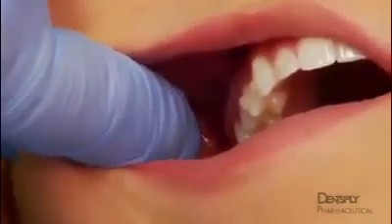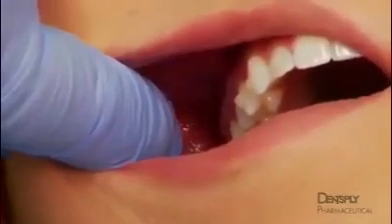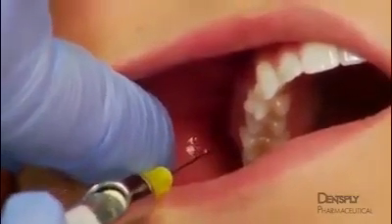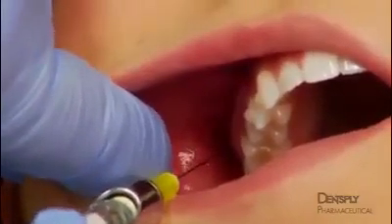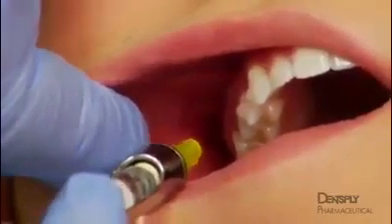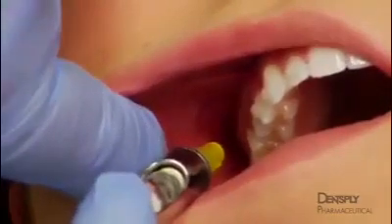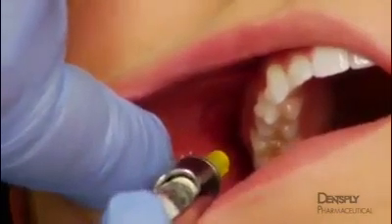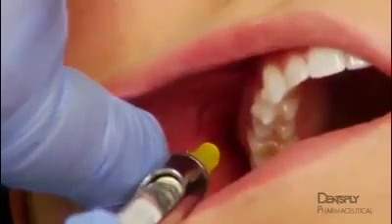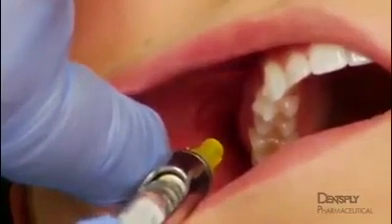The needle is carefully advanced to the insertion point and oriented medially as well as posteriorly and superiorly. For the average adult, the needle access should be at an angle of 45 degrees to all three planes. The needle is slowly advanced to a depth of 15 millimeters. After careful aspiration, 1/2 to 1 cartridge of anesthetic solution, or about 1 to 1.8 milliliters, is slowly injected.